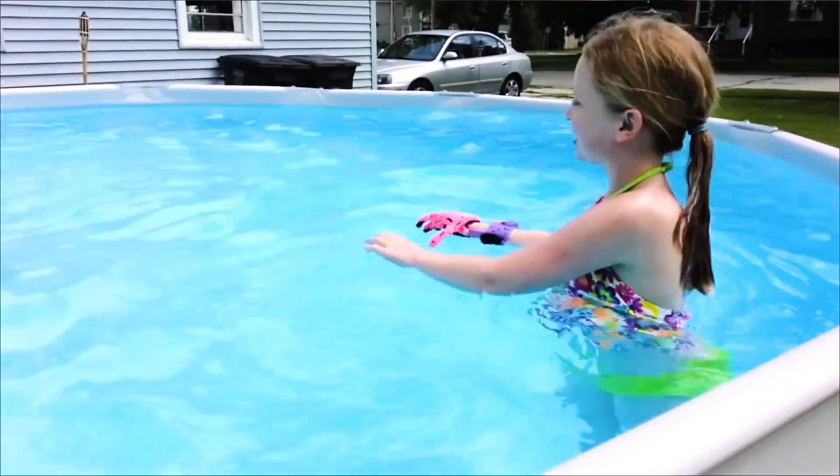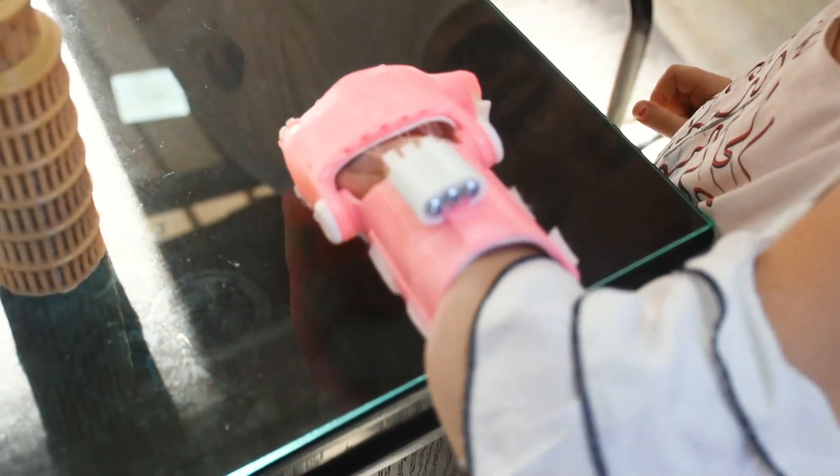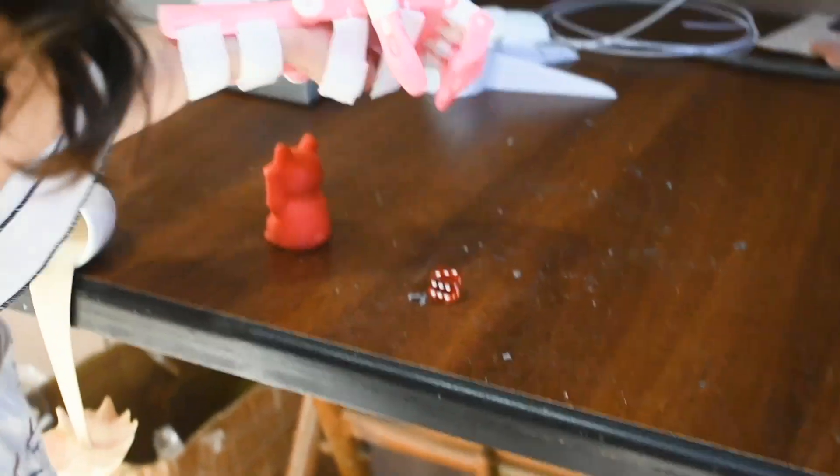The ENABLE community has delivered thousands of free prosthetic devices to people around the world, and the ENABLE Web Central application continues to match volunteers with recipients in need.